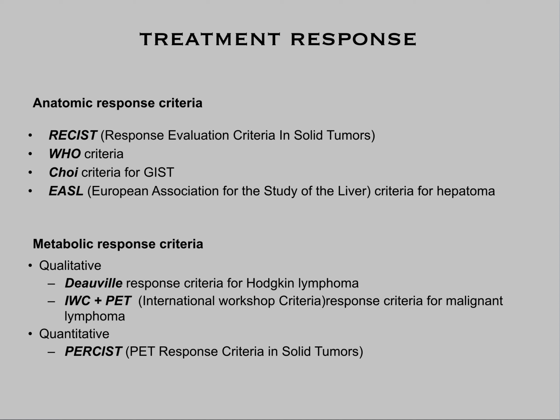Treatment response, there's a variety of response criteria. Most of the criteria use PET as evidence for presence of a tumor or development of new lesion, not SUV max. However, there are metabolic response criteria as well. Deauville, which is used as a part of Lugano criteria, uses visual assessment of FDG uptake to assess response to lymphoma. And the proposed tumor response criteria for PET, PERCIST, use SUV peak to assess the hottest lesions between the scans to determine the treatment response.